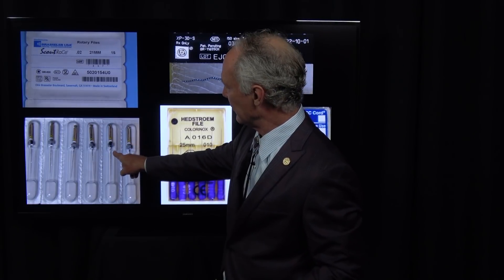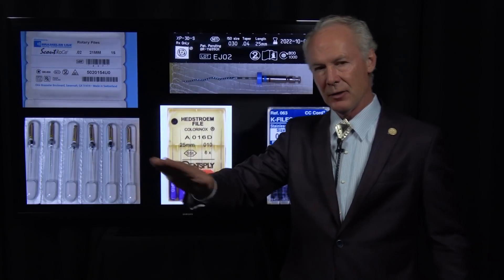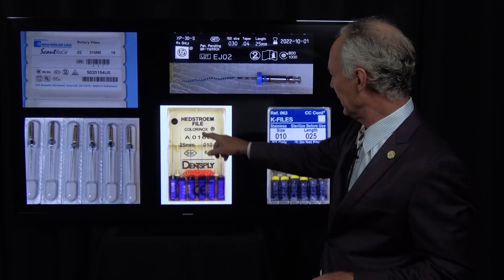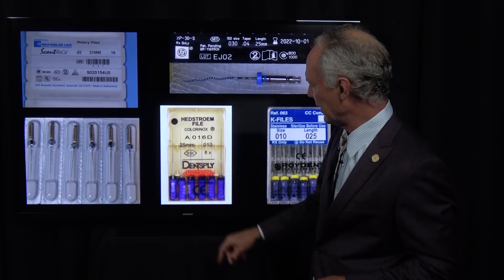Here's what you need to perform a root canal these days. This scout file is invaluable for finding canals. If you've got an elderly person or somebody with sclerotic canals, this is a gem. Once you make the access opening, if you can't find that canal, just take this on your handpiece and poke on the roof of the chamber — if it's there, you'll find it with that scout file.